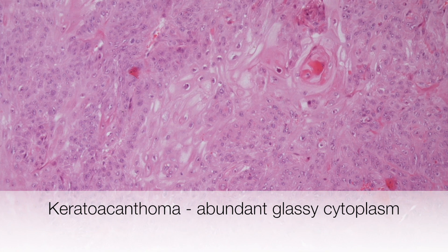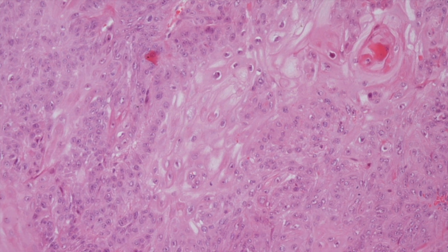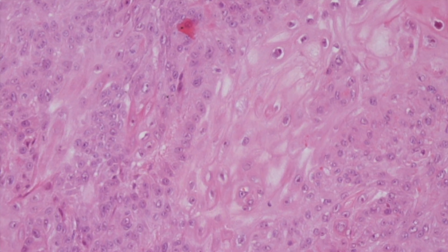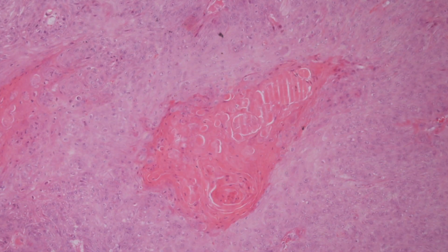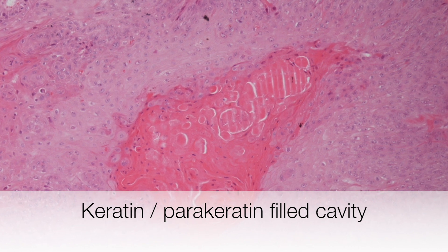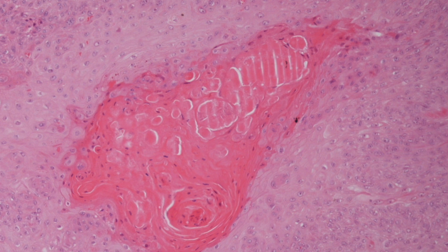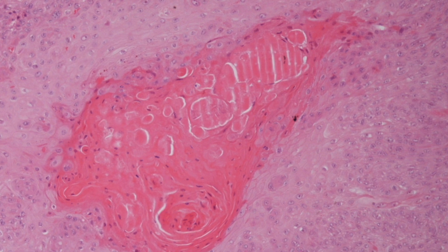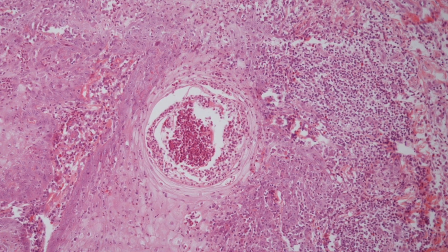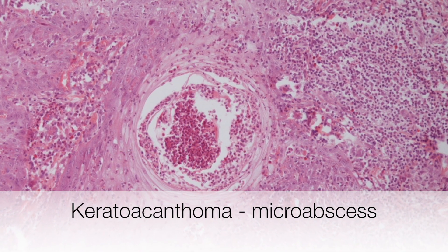On higher power, you can see that some of the keratinocytes have abundant glassy cytoplasm. Here is another feature of keratoacanthomas — the keratin- and parakeratin-filled cavities. And this area shows a micro-abscess.